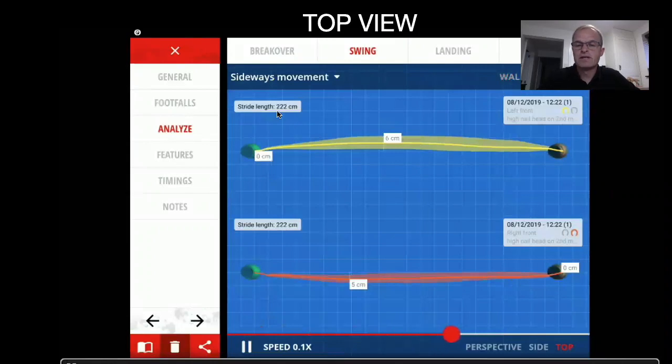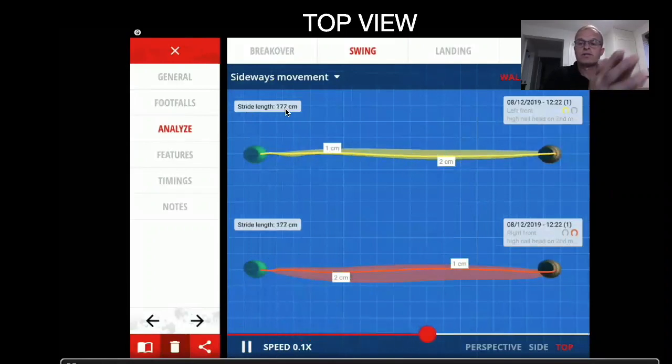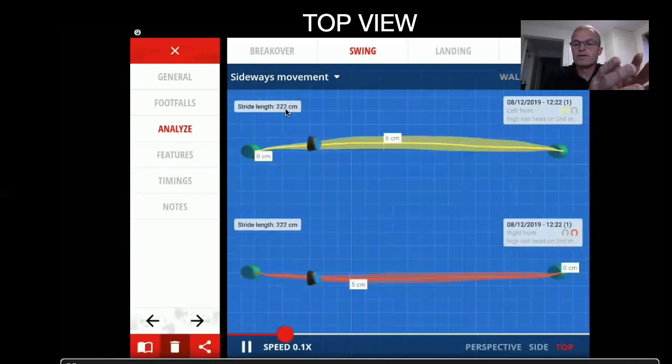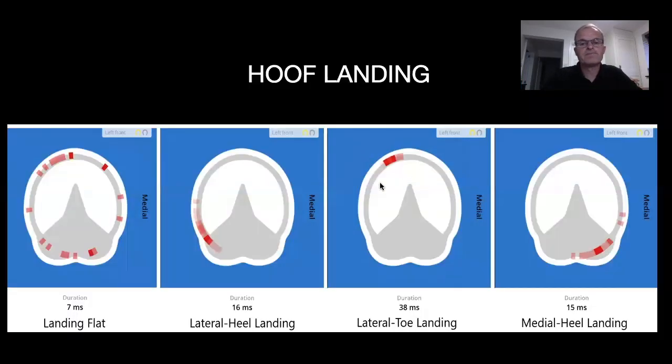Going back to the opening slide with the speed, as long as you've got the same speed, and that's why experienced holders always use the same person to trot up before and after. This is something, if you've already got a device, I reinforce that again. Try and use the same person, because everyone trots at a different pace. So it's good to use the same person before and after.